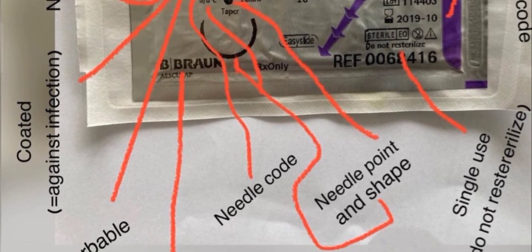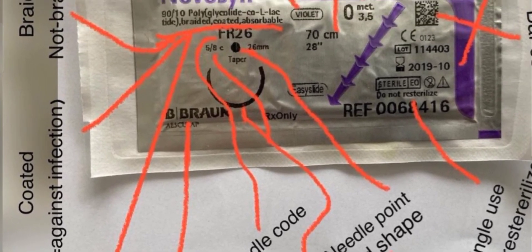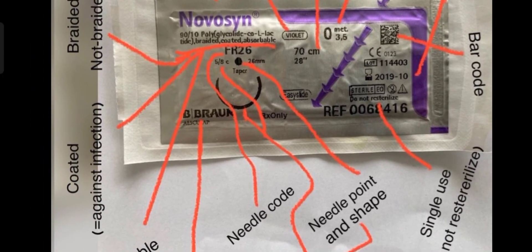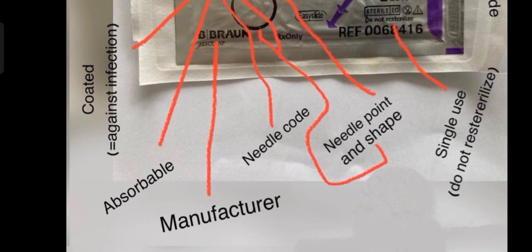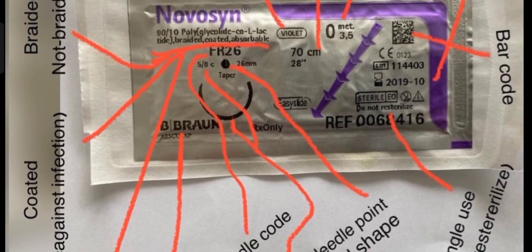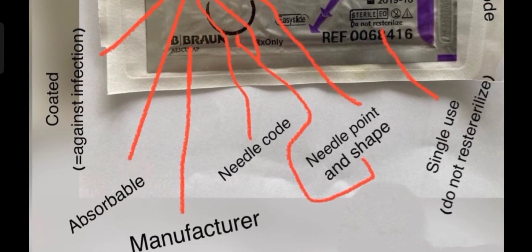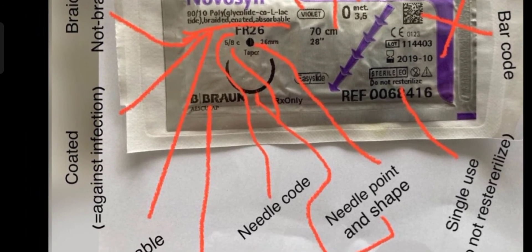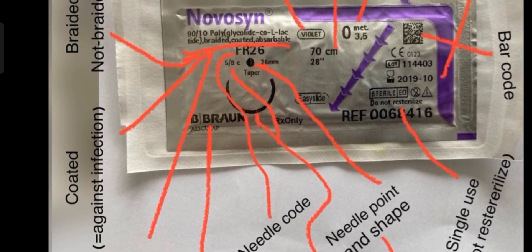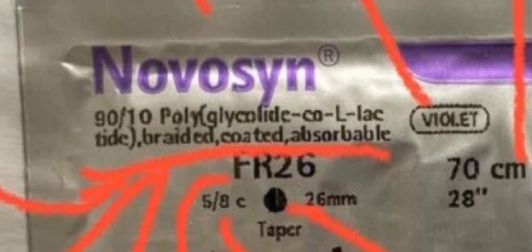This is important — first you are seeing a circle, which depicts the needle point and shape. Then 'FR26' is the needle code. 'B. Braun' is the manufacturer of this suture. It is written that it is absorbable, meaning it's an absorbable suture, and it is coated against infection — let me zoom in so you can easily see it.